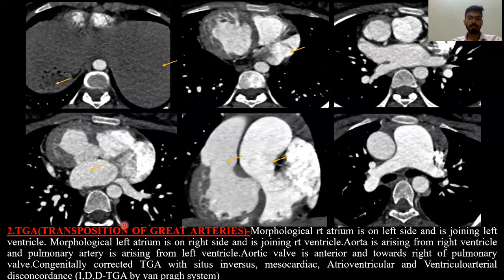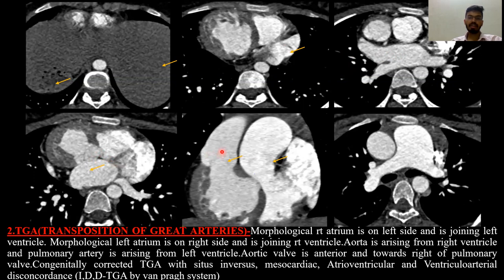The second case is TGA — transposition of great arteries. Situs inversus is present, as the stomach and spleen are on the right side and liver on the left side. The morphological right atrium is on the left side and joins the left ventricle, while the morphological left atrium is on the right side and joins the right ventricle. The aorta arises from the right ventricle and the pulmonary artery from the left ventricle. By the Van Praagh system, this is congenitally corrected TGA with situs inversus, mesocardia, and atrioventricular and ventriculo-arterial discordance.